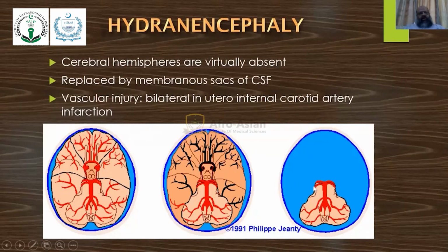This is the condition of hydranencephaly, in which the cerebral hemispheres are not formed, the vasculature is not formed. So we will just see the hindbrain. Here the hemispheres are there.